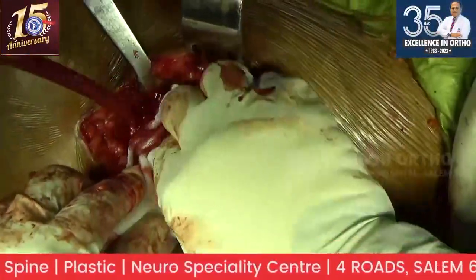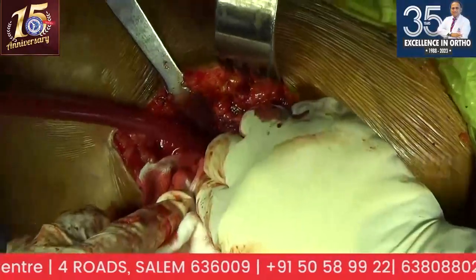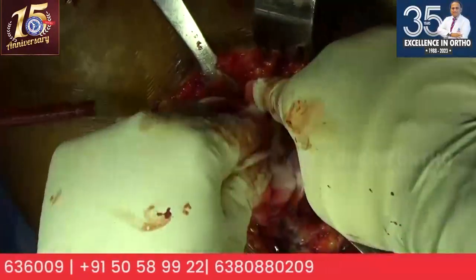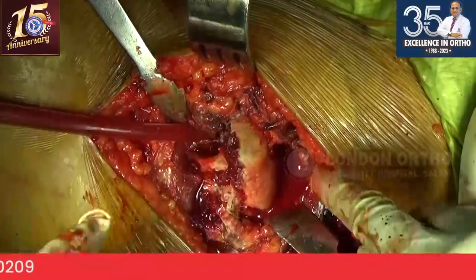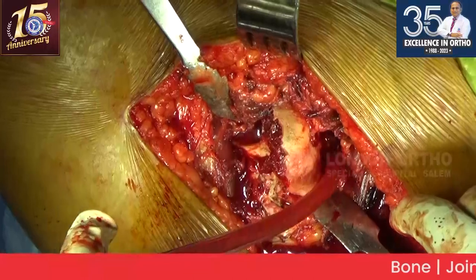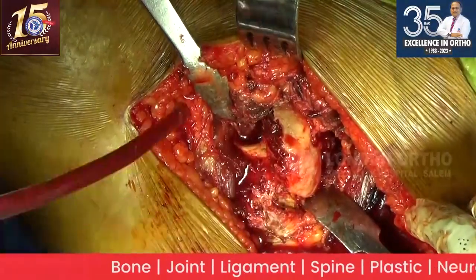What stem is this? We have a Corail design 135 and then a cemented 125. The neck shaft angle is an independent parameter, and you must choose a neck shaft angle close to what you want in that patient. That's correct. It is independent of offset. So I would think a 127 would be a better option here for sure.